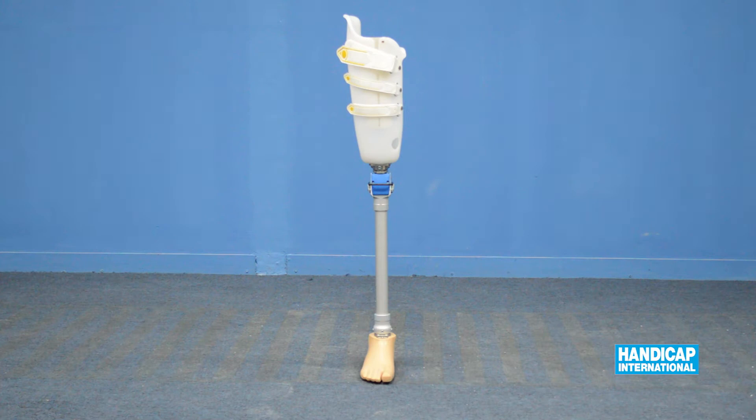We align the components of the processes so that the alignment line passes between the first and second toe, to the center of the knee, and at the socket 60% lateral and 40% medial.